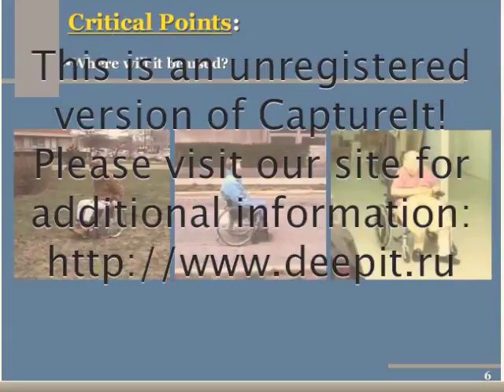Okay, let's not forget about the environment. Where does the individual intend to use the chair? Primarily indoors, like the woman in the slide on the right? If so, what is the flooring like? Is it linoleum, low pile carpet, high pile carpet? And you thought that just answering the question of will it be used indoors with a simple yes was enough. As I noted once before, never accept a simple answer to the simple question. The conversation must continue. Will the person use the chair primarily outdoors, or a good combination of indoors and outdoors?